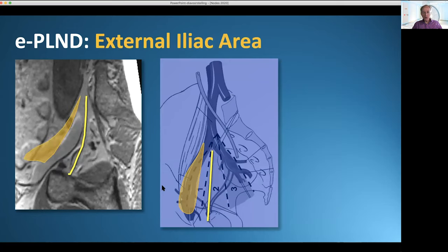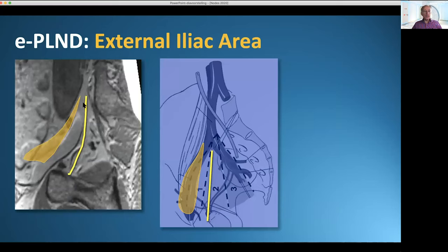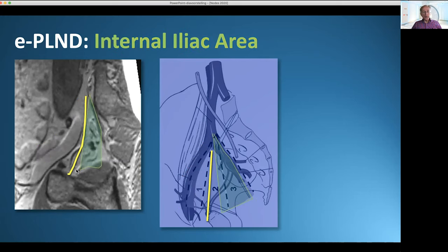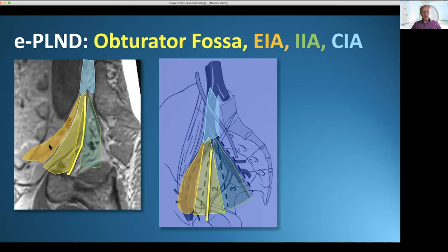The area dorsal to the external iliac vein and around the obturator nerve is the so-called obturator fossa, and in this case there is a positive lymph node in the fossa. Anterior to the obturator fossa is the region of the external iliac. Dorsal to the obturator nerve is the internal iliac region — rather difficult because there are a lot of vessels which cause bleeding. Cranially to the iliac bifurcation is the common iliac region: external, obturator, internal, and common.